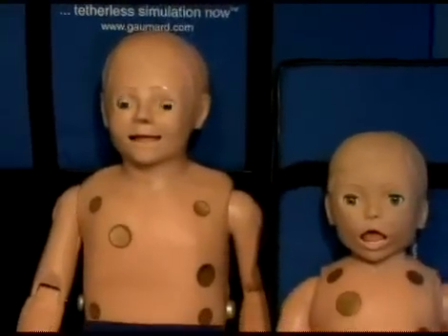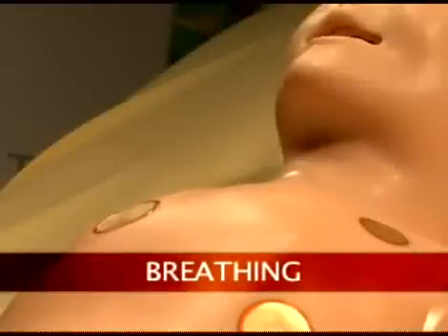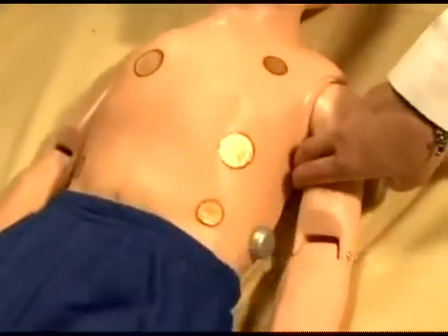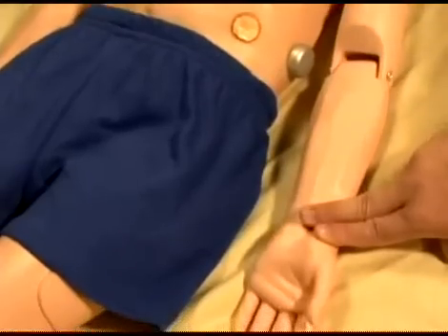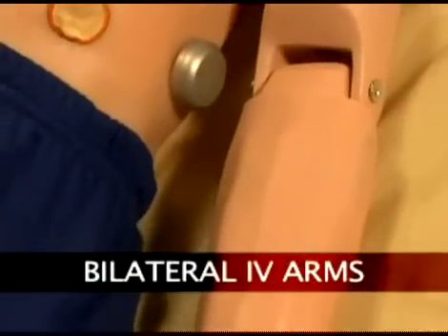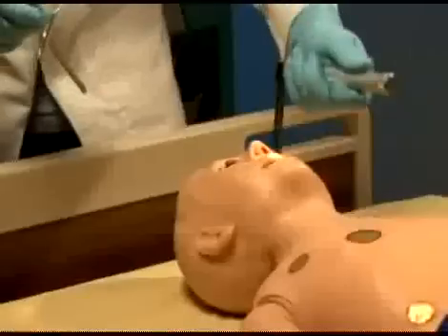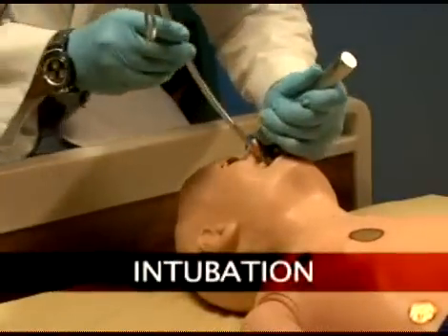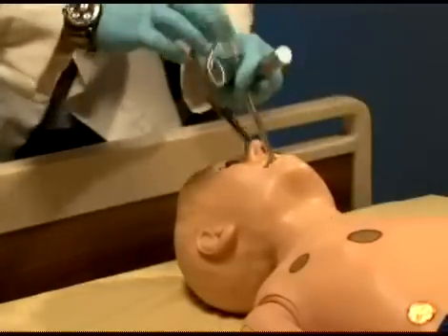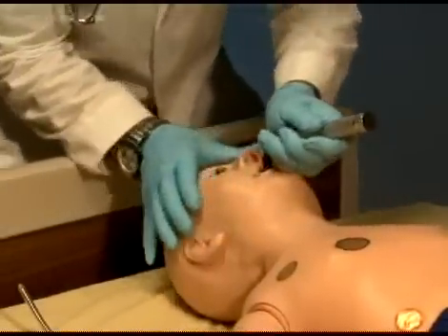Pediatric HAL has many other features, such as a realistic airway, breathing, palpable pulses, and bilateral IV arms. Pediatric HAL's airway can be intubated both nasally and orally using an LMA or endotracheal tubes. Intubation can be made more difficult by turning on tongue edema.